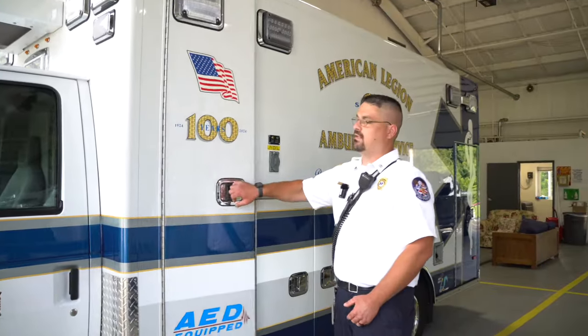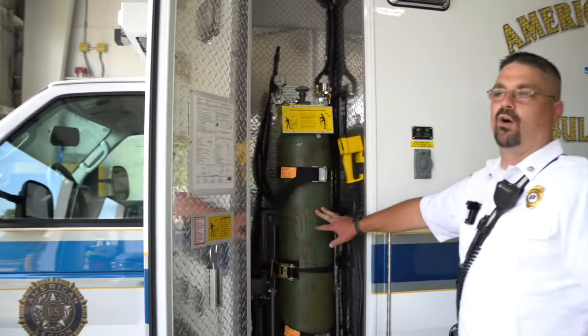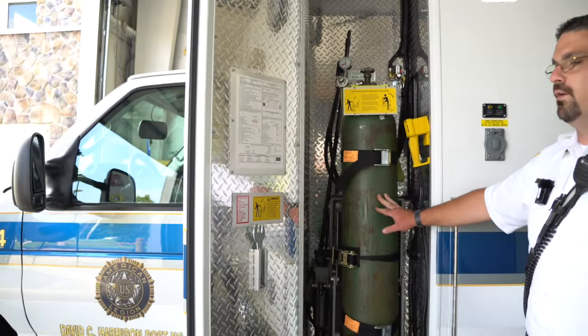Starting around the outside, this is the standard oxygen compartment — this is where all the oxygen is stored for the main supply on the unit.